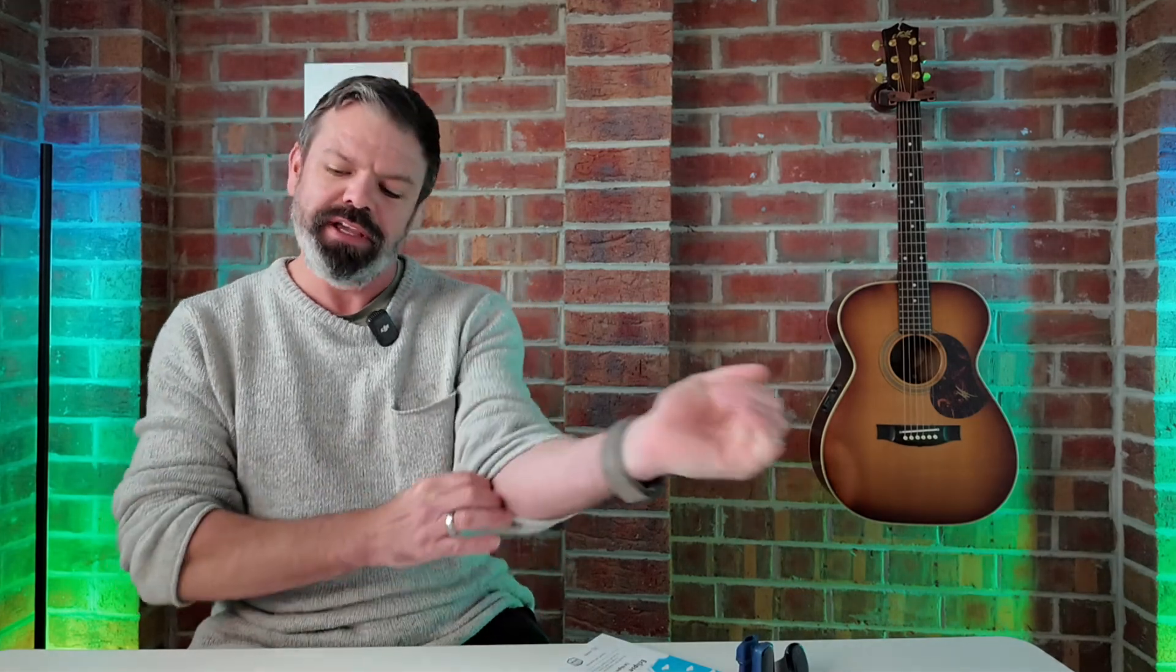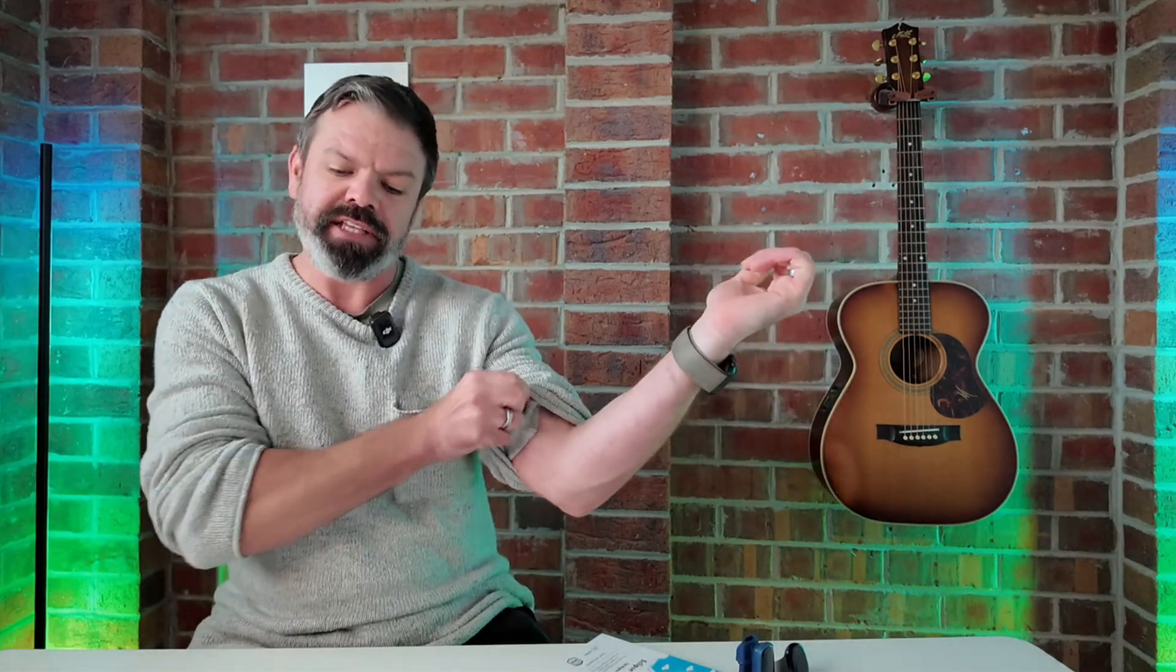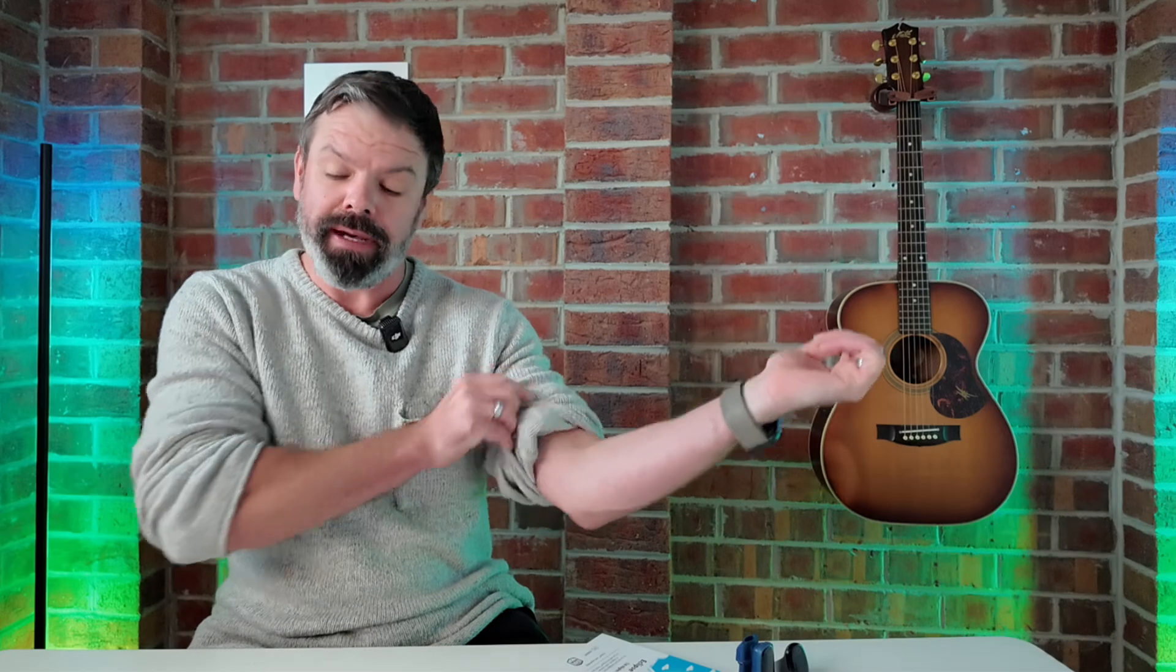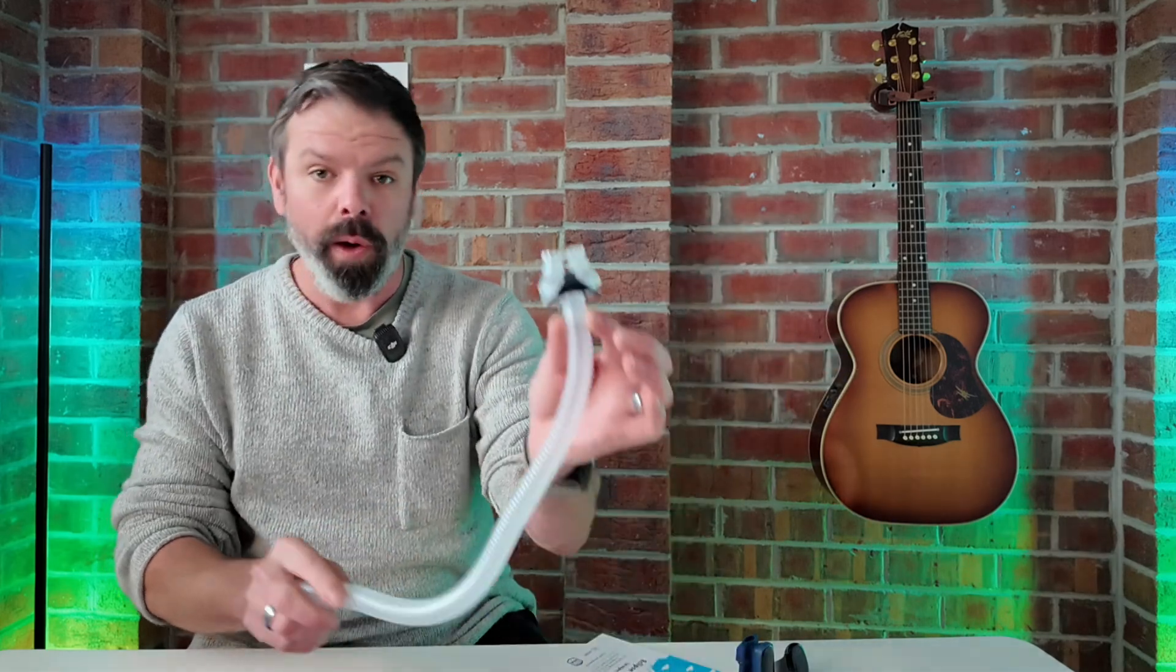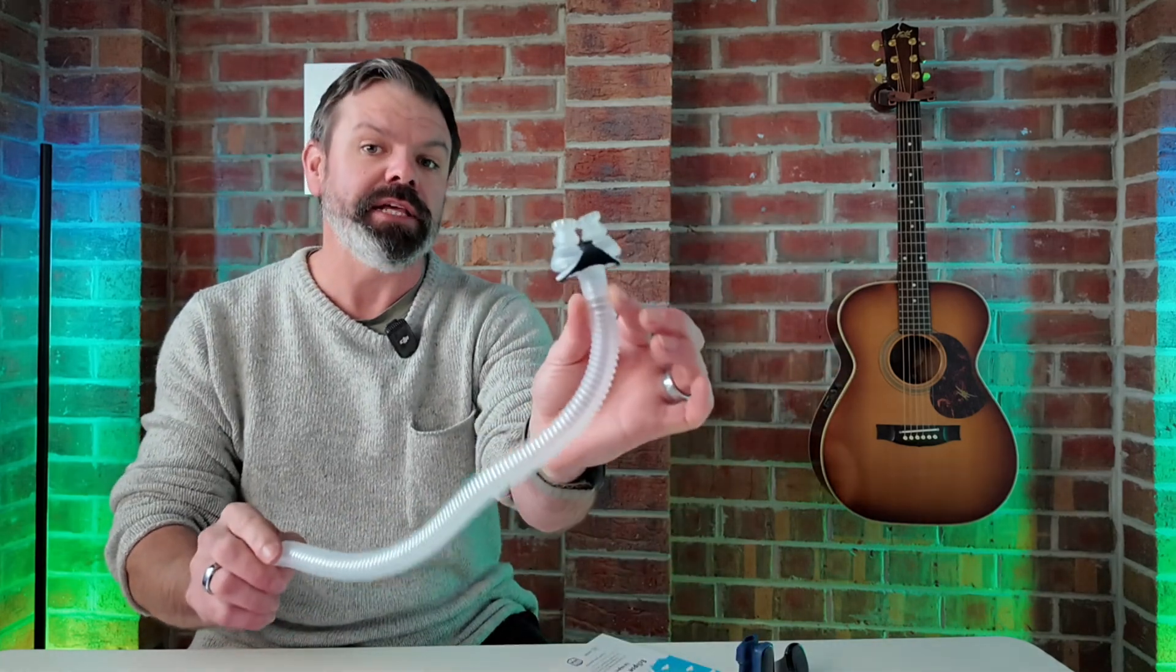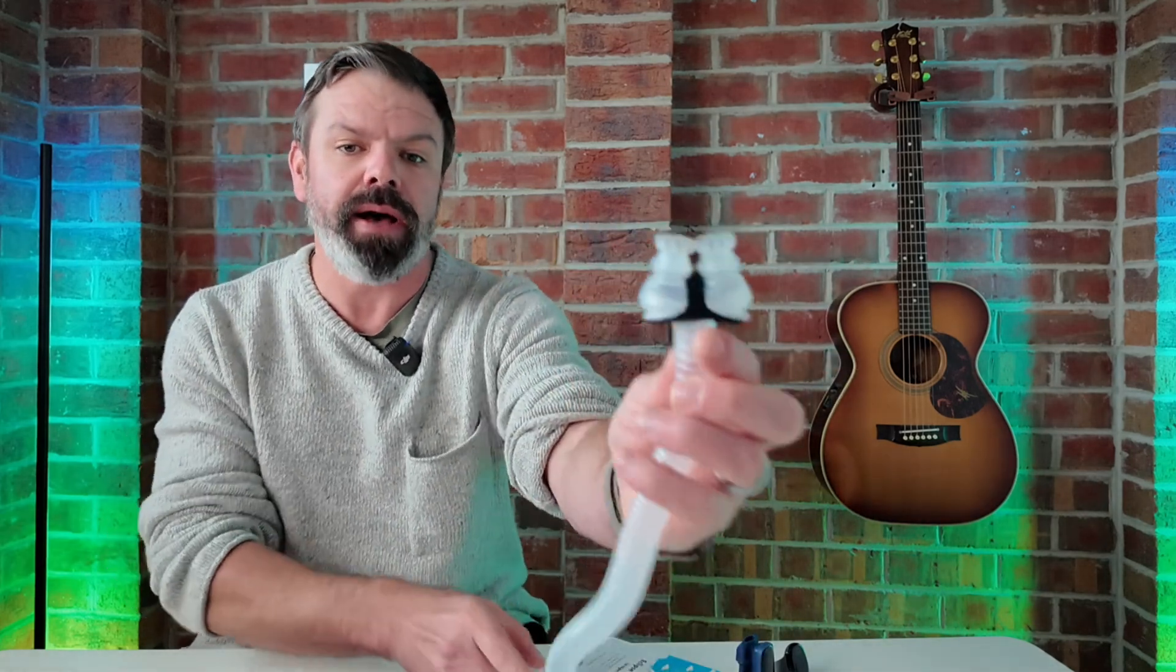How does he sleep like that? How can you sleep with that motorboat going on? Nice and easy one today guys. I'm going to show you how to spot CPAP mouth leak right here on Sleep HQ, and it's a great example because the member is using a Bleep Eclipse CPAP mask.